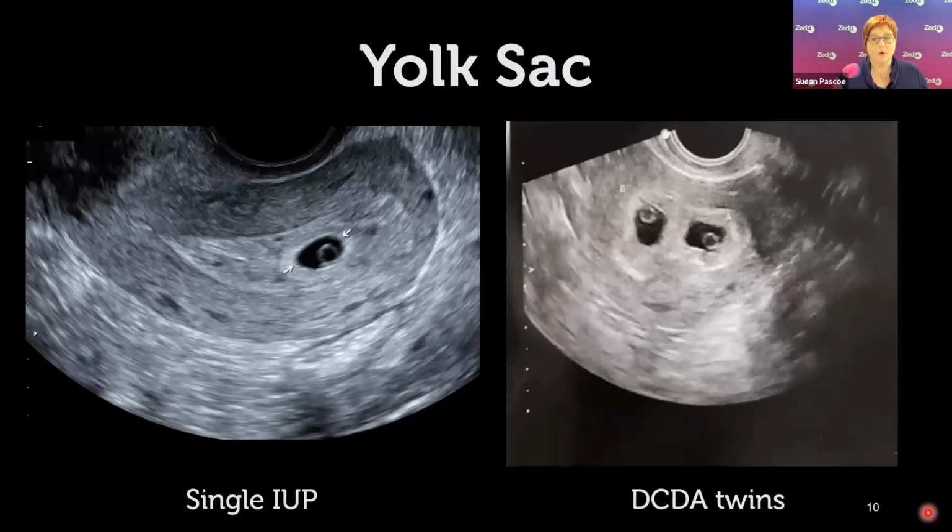It's positioned between the chorion and the amniotic membrane, and we can see that yolk sac up until about 12 to 13 weeks gestation, by which stage the chorion and the amnion have grown so large and are almost fused, and so it makes it difficult to see the yolk sac after that. Apparently it's still there though.